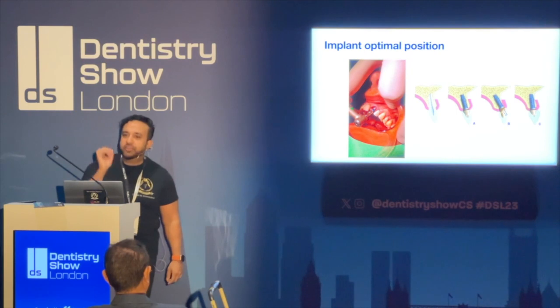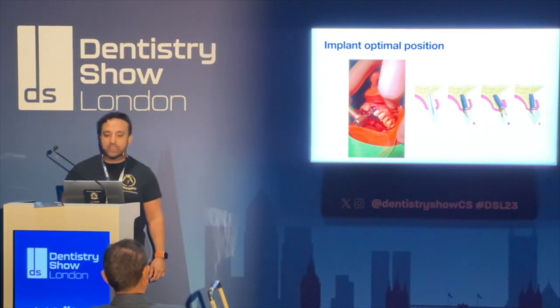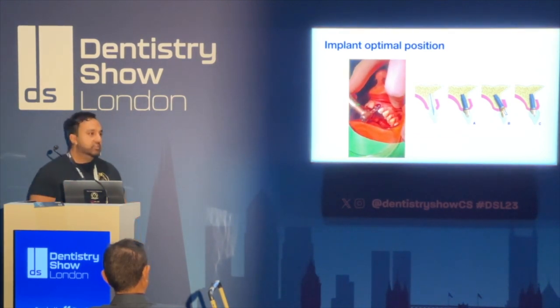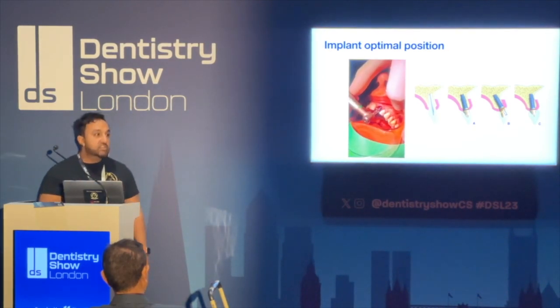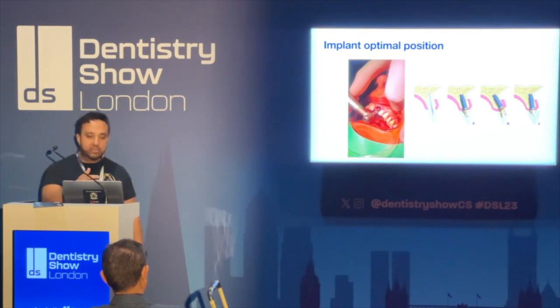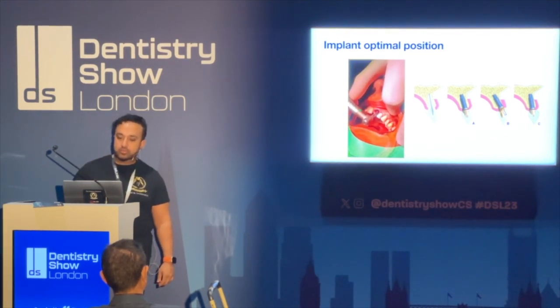The beautiful thing about where technology has taken us today with implant dentistry is we're able now to remove a front tooth that's fractured, that you can see here, and actually place an implant at the same time. It's known as an immediate placement. And the major benefit of this is not multiple surgeries. We can use the bone with the current implant design. This was a Straumann implant that I placed, a BLT, straight into the socket itself using the palatal wall.